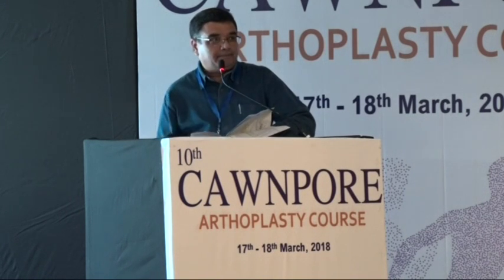But I find it quite difficult, if there's a 5 millimeter defect, to put a single screw in the correct position, perpendicular to the defect plane. Because if I don't put the screw perpendicular to the defect plane, the chance of me getting union also decreases. So swings and roundabouts. So I would suggest that, because the session is already too late, any further discussions can be made during this. Dr. Sanjeev Gokhale for his talk on uni versus total.